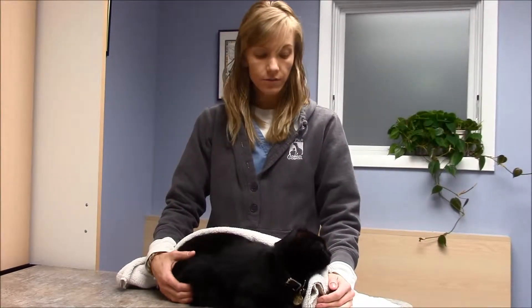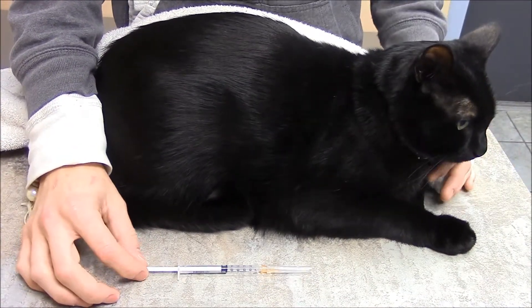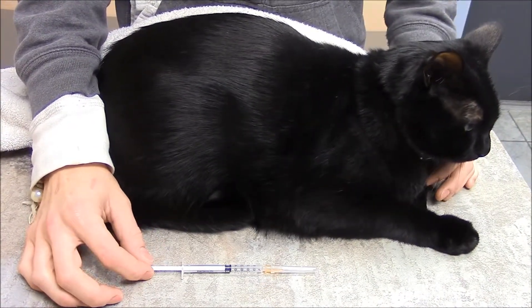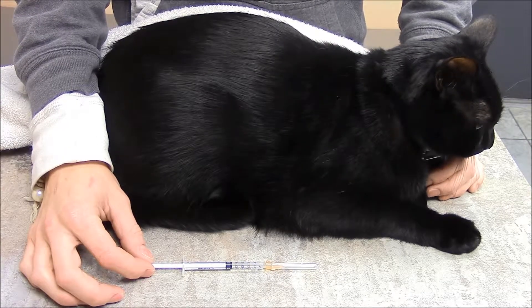My name is Stephanie, and this is Felix, and today we're going to show everybody at home how to give an injection under the skin. This is our syringe and needle, and today we're going to be using sterile water instead of actual medication to show this demonstration.